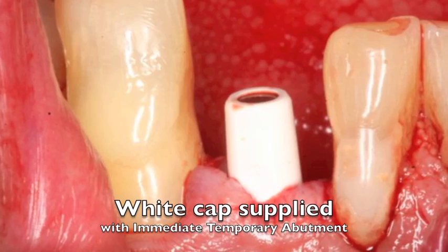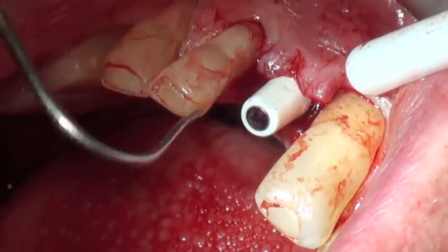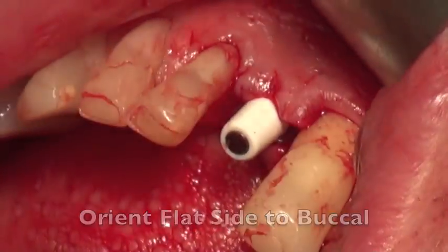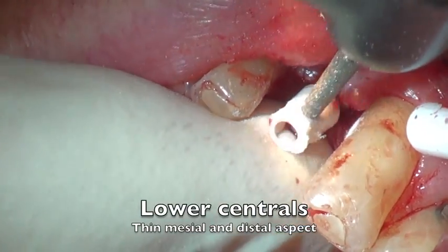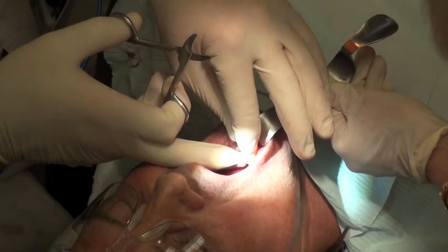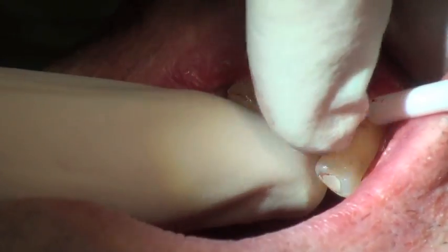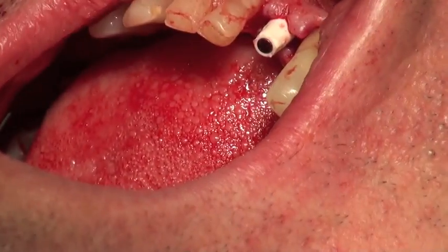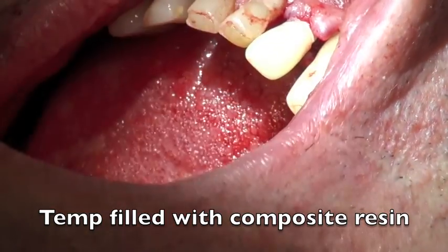We take the white cap supplied with the immediate temporary abutment and place it on top of the abutment, positioning it so the flat surface is in the front. This gives us a reference point for picking it up when making the temporary crown. We use an 8850KR diamond to shape the mesial and distal aspect to give a little more room for the resin, since this is a very tight area. We then place restorative resin inside the crown shell and place it on top of the abutment with the white cap underneath, picking up that white cap in the shell, and light-cure it.